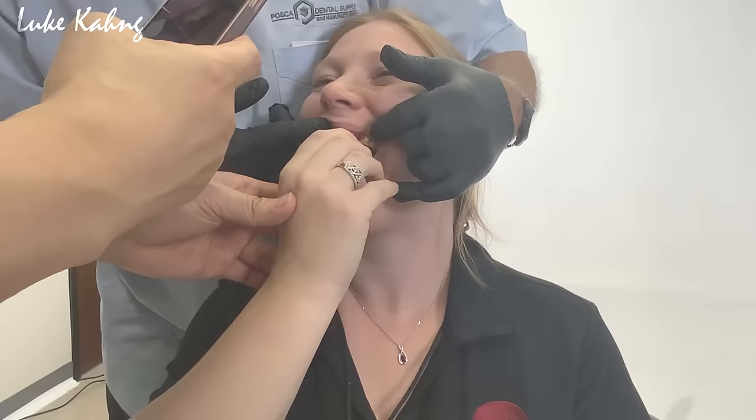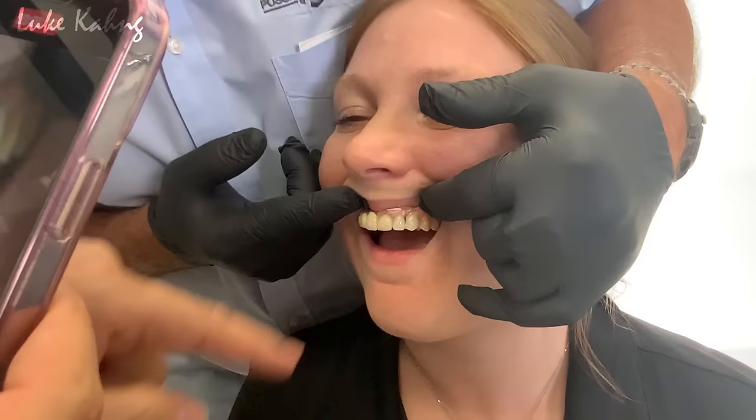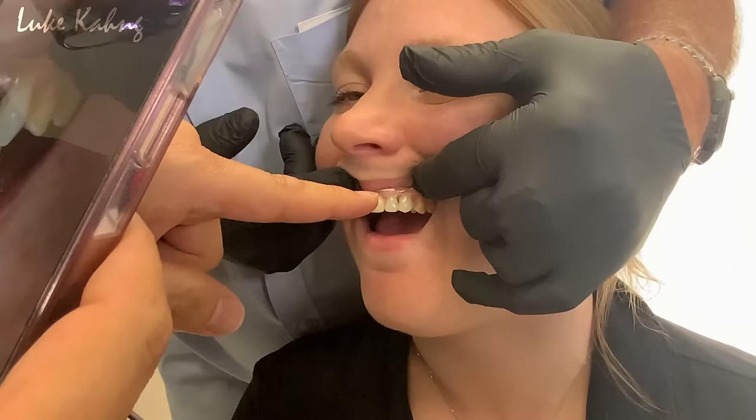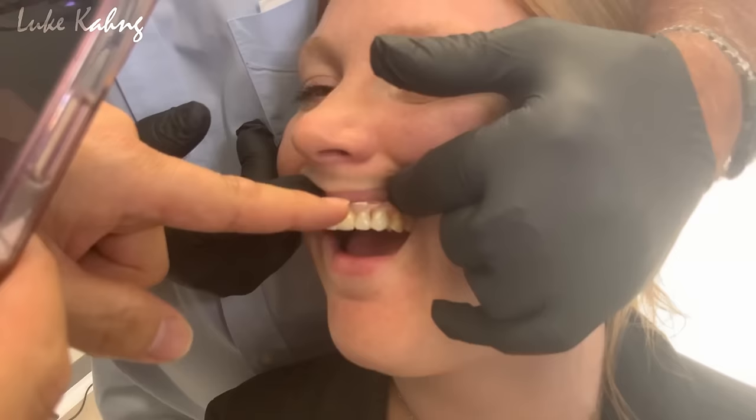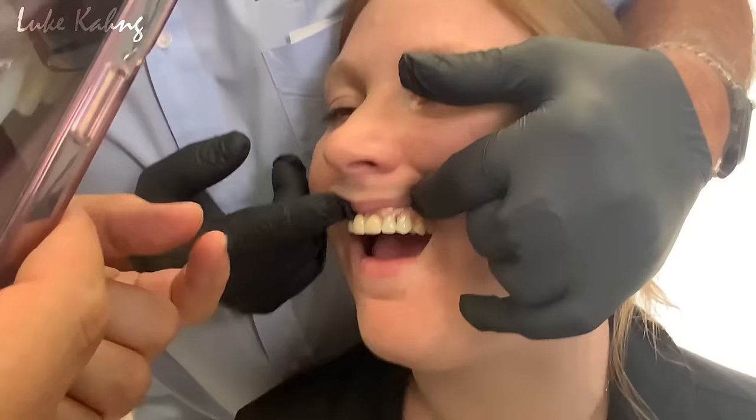Okay, great. All right, so this is the previous one, the old one actually. The problem is the black triangle in between the teeth because of the clear clasp in between the teeth. So that's why I created the black dot. It was not black actually, because you see the black hole, Frank made it with pink. So we eliminate that area, which is great. Take it out. So this is the old one with clear partial.